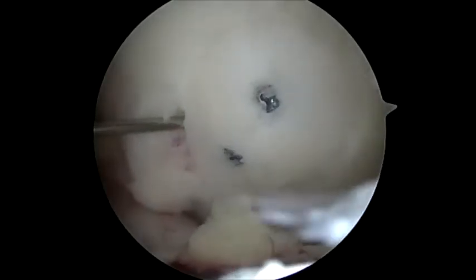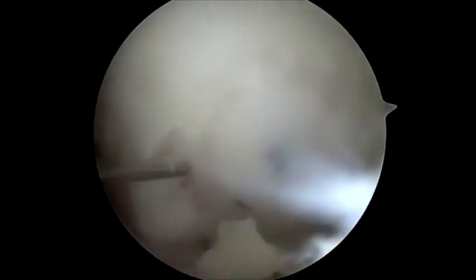Platelet-rich plasma was harvested and prepared during the procedure and injected in between the fragment and the medial femoral condyle cartilage edge to facilitate wound healing. In addition, bone graft or bone putty may be used in cases where there is a large osteochondral defect.